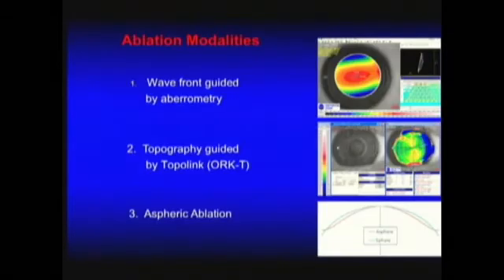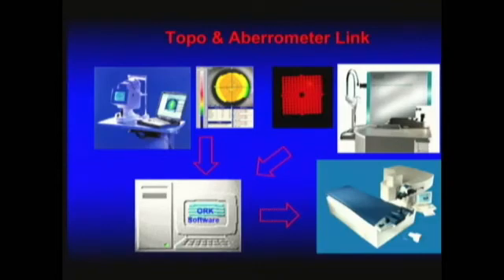So after you get the topography and the aberrometry, you analyze that in the software, and that is sent to the laser.